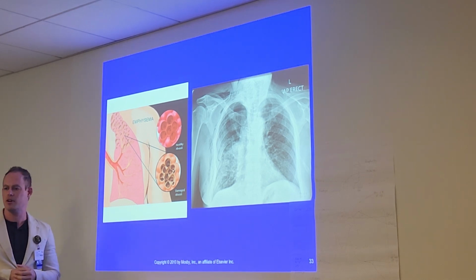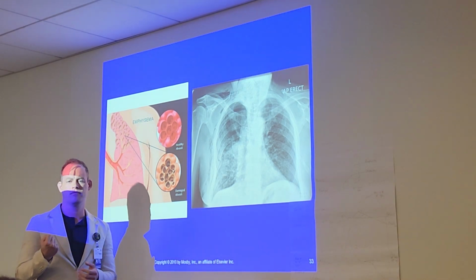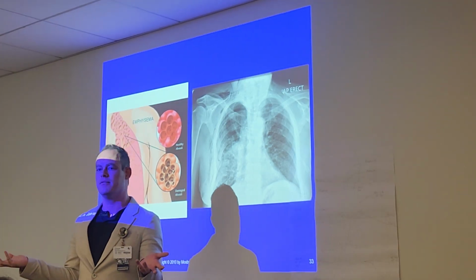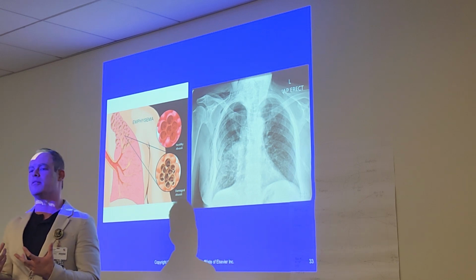Petrosis, yeah. Osteopetrosis. So what's that referred to? Hardening of the bone. Bones getting thicker and harder. Therefore, what do we do with the technique there? Increase it, it's a thicker area to penetrate.